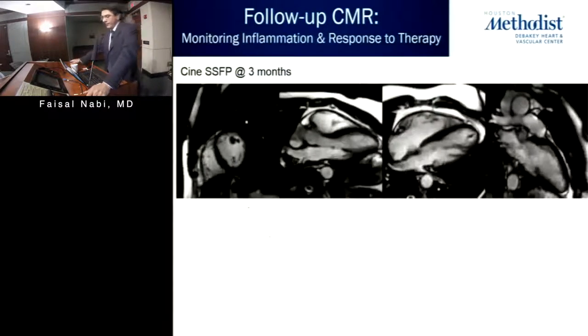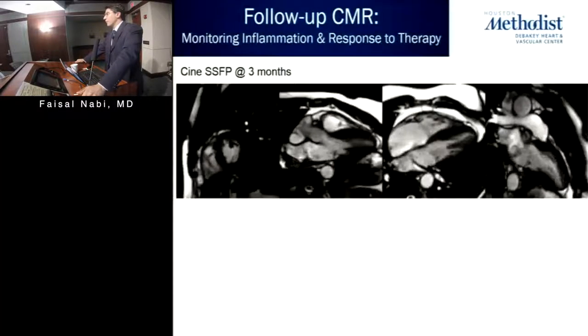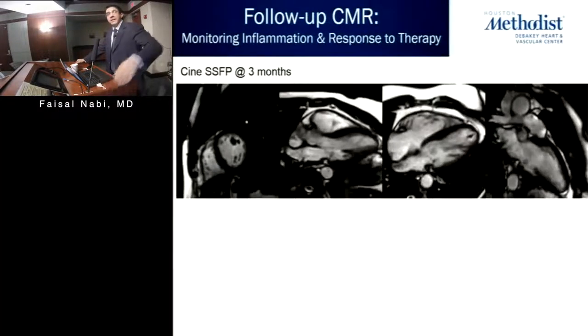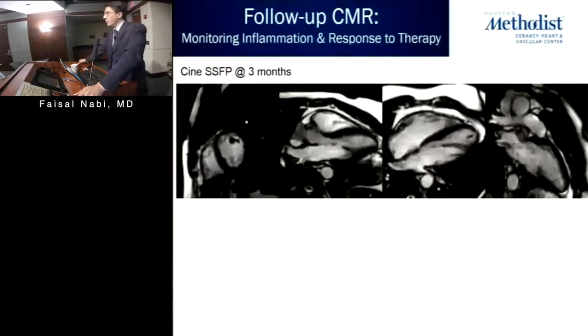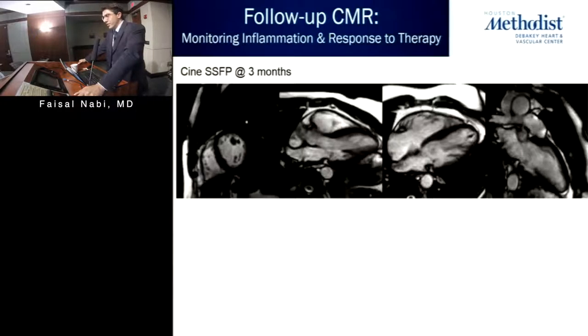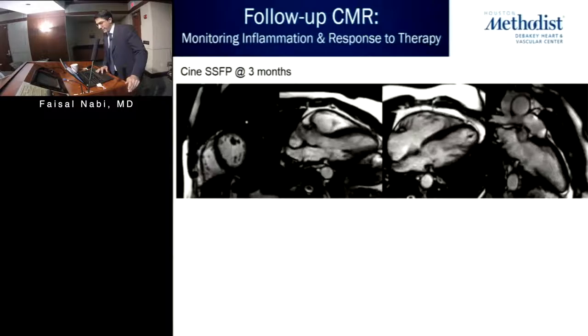I can tell you another area where CMR can potentially help you, and there will be more on this in the upcoming slides. This patient was treated with, of course, a prolonged period of antibiotics, as well as anti-inflammatories to help with the inflammation and constrictive physiology that was seen. And this is his CMR at 3 months.